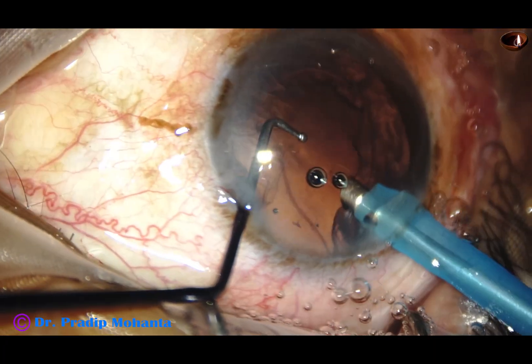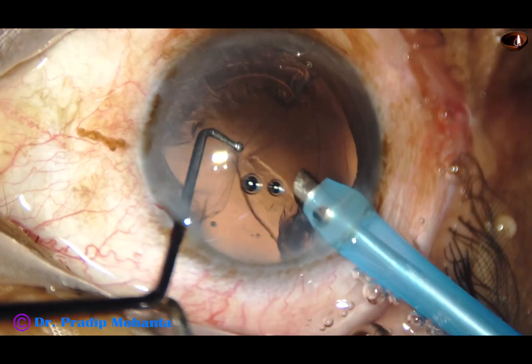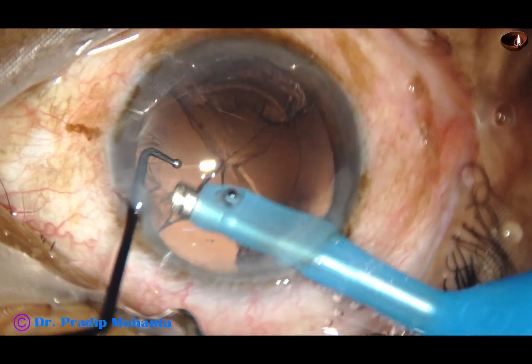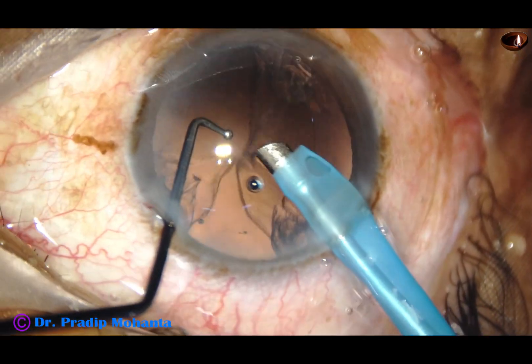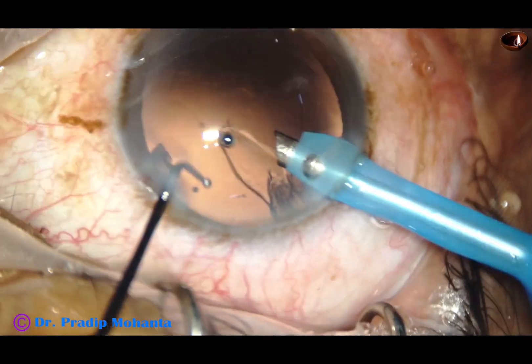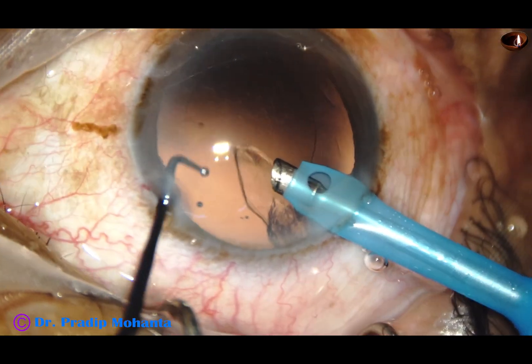Now, this is removal of the cortex by the handpiece itself. Before you do this, you must check if the zonule is weak and if the posterior capsule is trampolining — meaning if the posterior capsule is coming forward and going backward frequently. If it happens, don't try this. Otherwise, you can try a little bit of movement every day and one day you can become expert in removing the cortex by the handpiece itself.